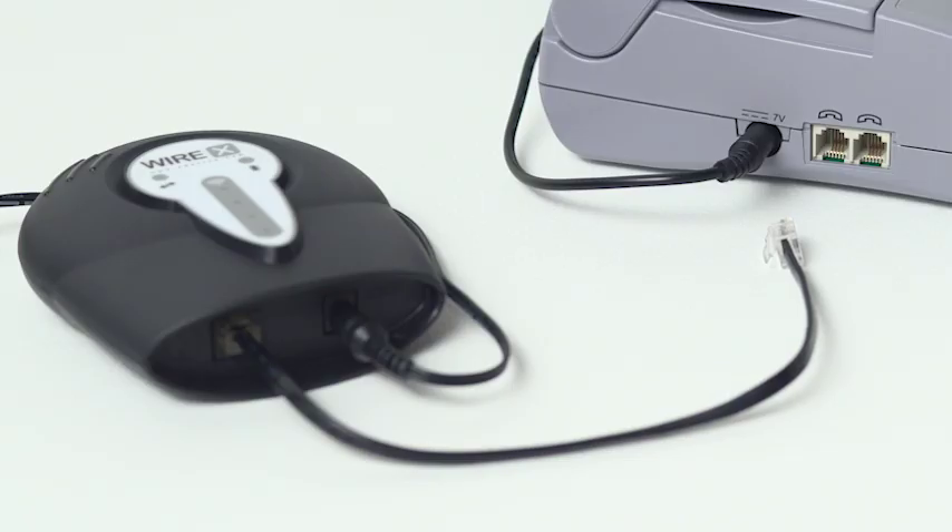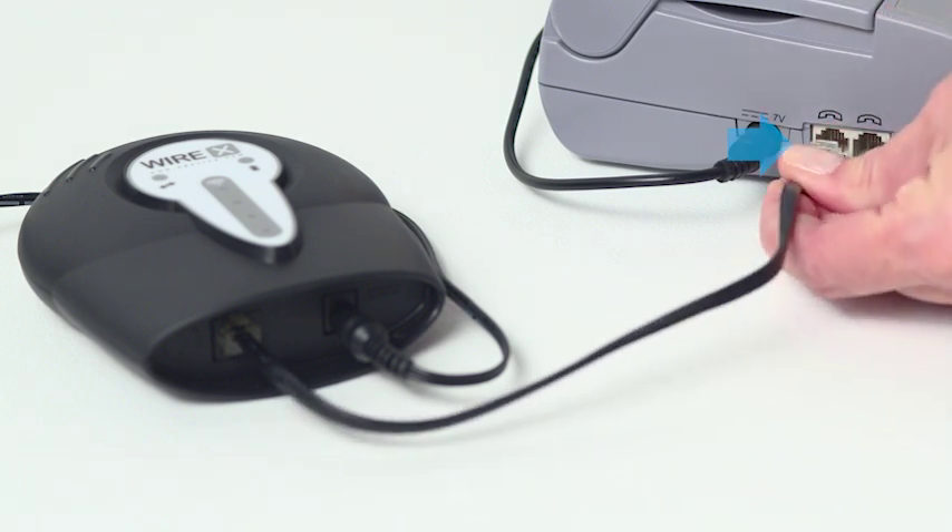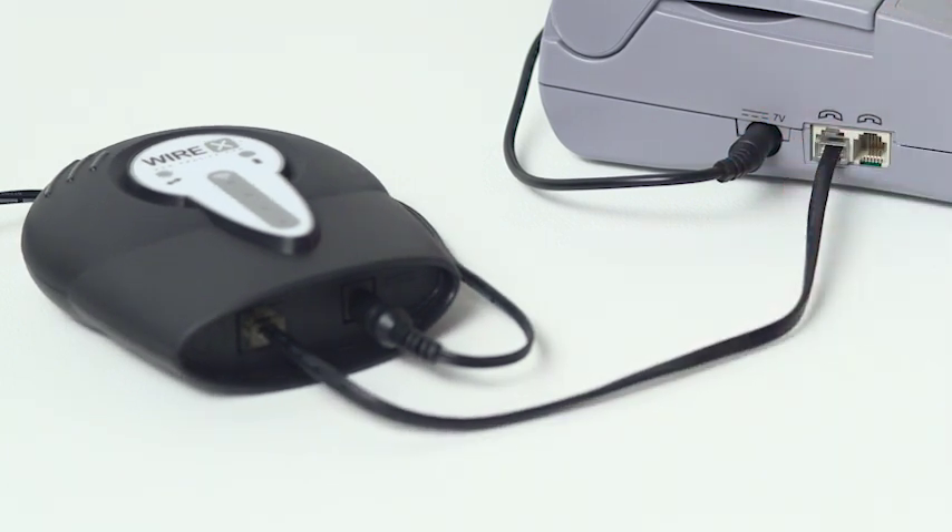Next, we'll connect your new cellular accessory to your CareLink monitor. Just insert the end of the phone cable from the cellular accessory into one of the phone jacks on your CareLink monitor. Push it in until the clip snaps into place.